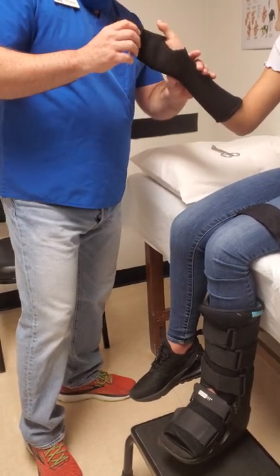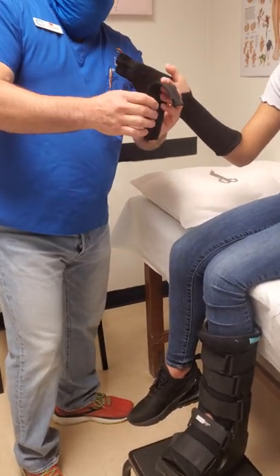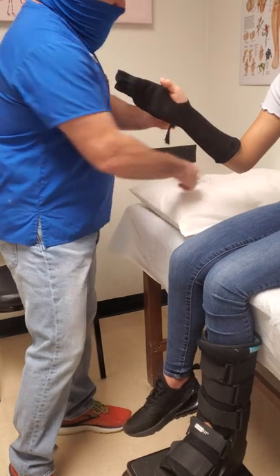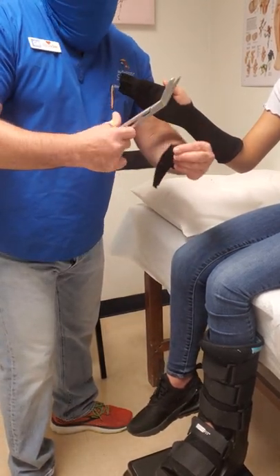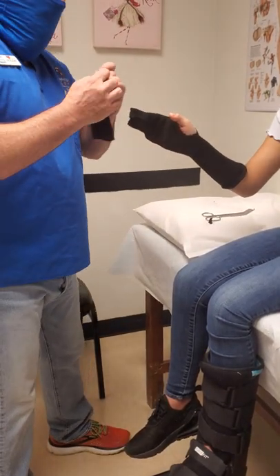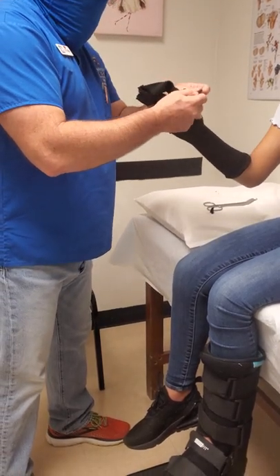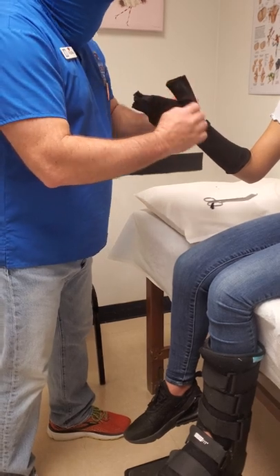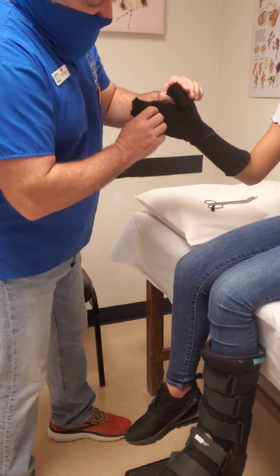Slide your thumb out nice and gentle because remember the thumb is injured. Then we're going to take the thumb cover and fold it about a third of the way down and cut the corner off, again like we did with the short arm cast. But this one — the thumb sleeve — is a little bit longer because in this particular case the surgeon has asked for the thumb to be included in the thumb spica cast all the way to the tip of the IP, the interphalangeal point. That's the sleeve.